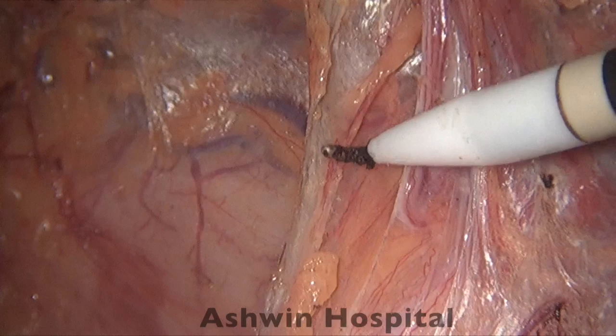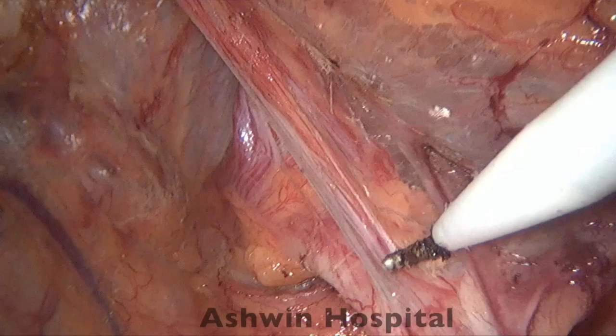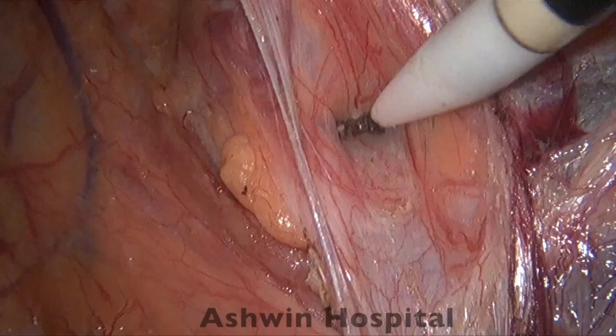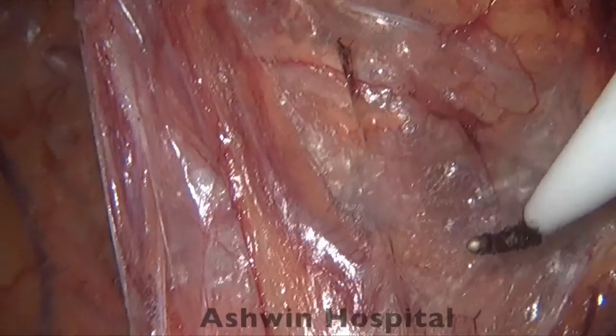So this is done till the vas turns medially and it crosses the medial umbilical ligament, which is formed by the obliterated umbilical artery. You can see the pulsation of the external iliac artery and the collapsing of the vein also very clearly. Now we are just carrying on with the parietalization and mobilizing the vessels, testicular vessels, away so that the parietalization is nice and comprehensive and the mesh can be placed well without the uprolling of the lower border of the mesh, which will be lifted off by the peritoneum if you don't do the dissection well, and that is one of the major reasons why a recurrence would happen very soon in the postoperative period.